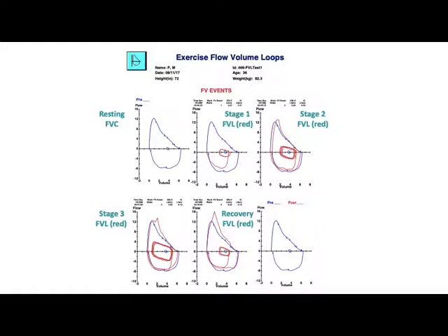And in many cases, you see this little red tail on these flow volume loops. At the end of the maneuver, the computer has no idea where to put your exercising flow volume loop in relation to rest. It knows that you're breathing in and out at a certain flow rate, but it doesn't know if your lungs are half full or quarter full or seven eighths full. And so at the end of the maneuver, it prompts you to do a maximum quick inhale as quickly as you can. And the idea is that if you do it properly and you fully fill your lungs, it can anchor the flow volume loop to a completely full lung. It says, okay, well, I know from the resting scenario, this was completely full, the end of the tail, I match up with that point, and then that places the loop somewhere within my flow volume loop.